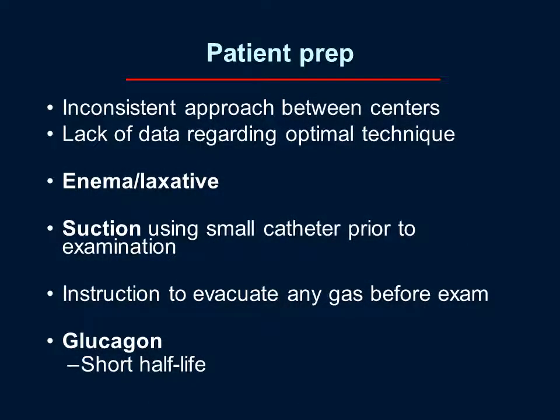So various aspects of patient prep have been attempted among different centers to try to address this issue, although approaches are inconsistent and there's really no data informing us as to a single optimal technique. Some centers are using an enema or a laxative to achieve an empty rectum. It's even been mentioned to use a small catheter or suction through a small catheter prior to the exam, say if initial scout images show a very distended rectum, to help try to avoid the artifact.